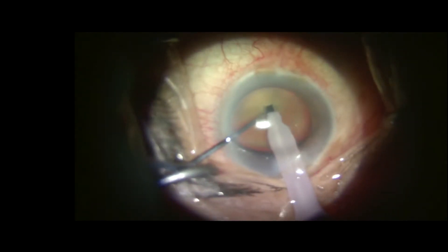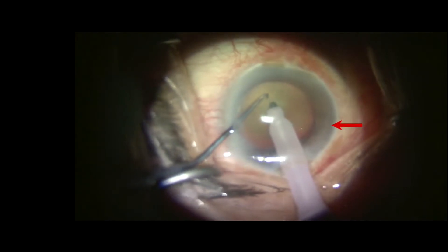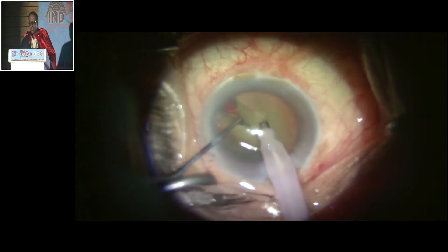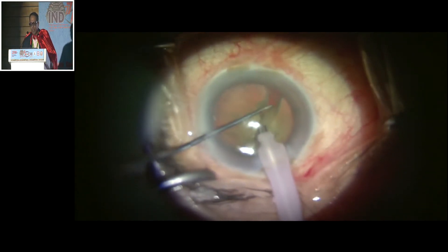At this point you will realize that there is a zonular dehiscence. I am going to do the direct chop, and with this direct chop I am going to separate the nuclear pieces.